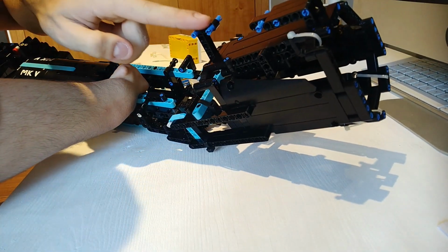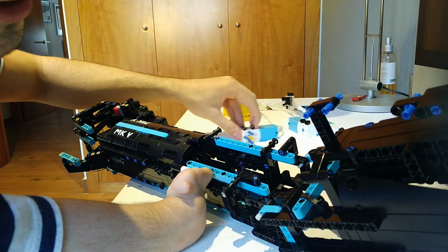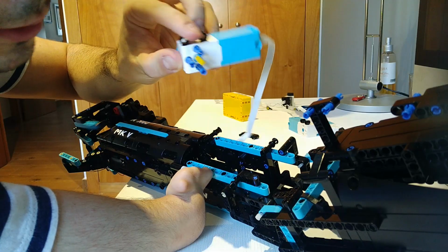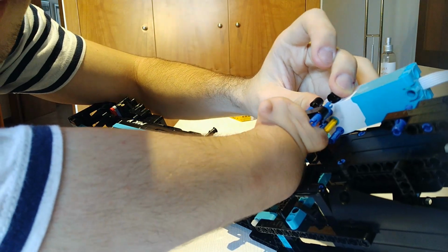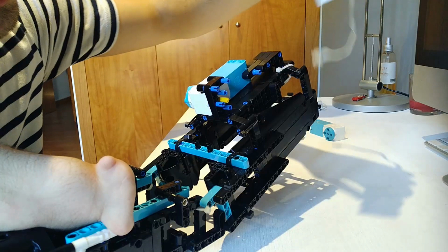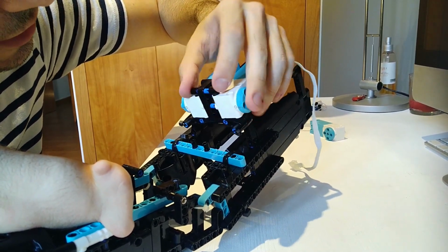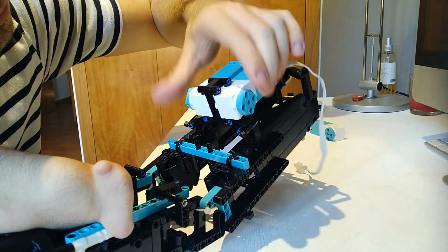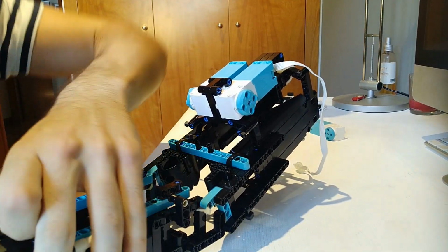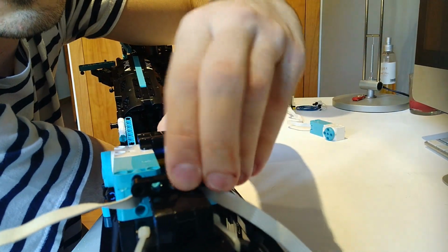Now you get the prosthetic. And right here, you're going to connect the black pins with the motors, and here, you're going to connect the motor. So that's where we are going to connect these black pins with holes, and it should look like this. This is one side, it fits perfectly. And now you need to connect the other side. It's a little difficult, there's plenty of things trying to connect together right here. And now you're going to grab this brick that we built before. And you see these 2 little holes right here. So you're going to connect this to the motors.